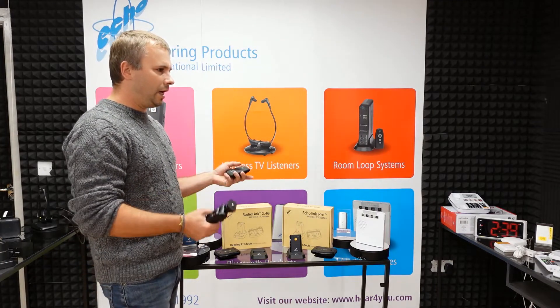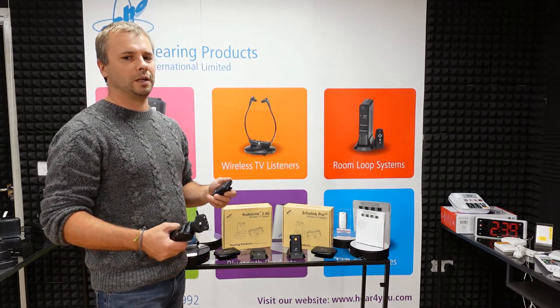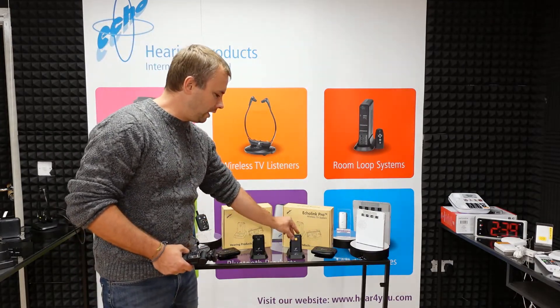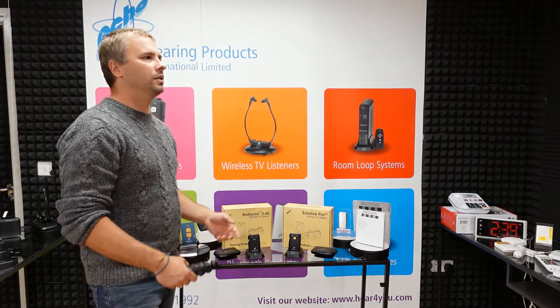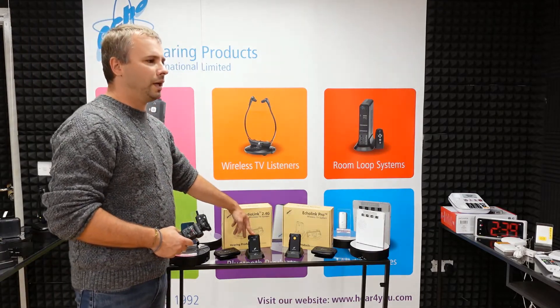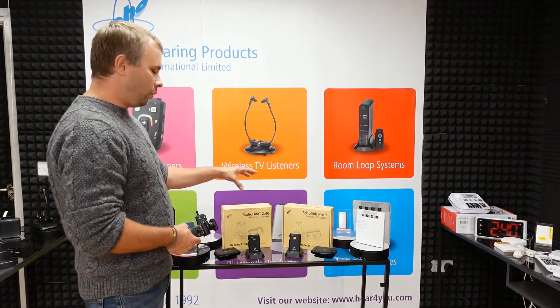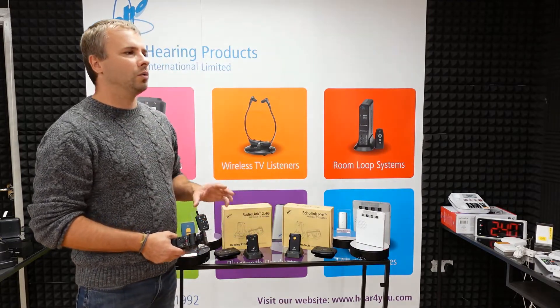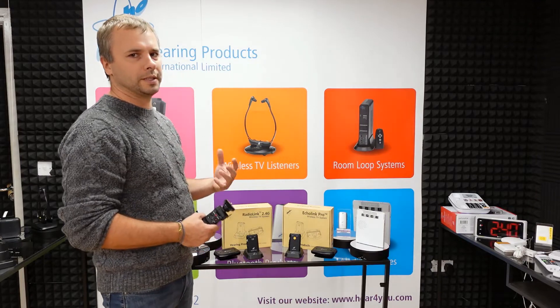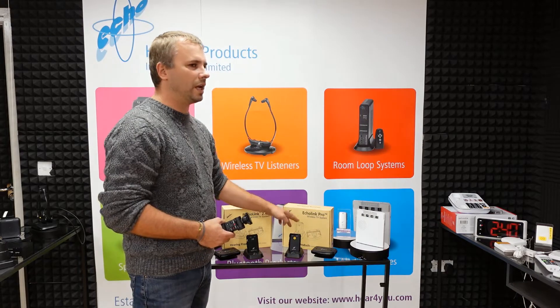As you can tell from the name, the main difference is the frequency. RadioLink 2.4 gigahertz transmits on a 2.4 gigahertz carrier frequency, whereas Echolink Pro uses infrared. To keep it simple, RadioLink 2.4G uses radio frequency, so with RadioLink 2.4 gigahertz you can go to another room — you have more freedom of movement around your house and you will still be able to hear the sound.